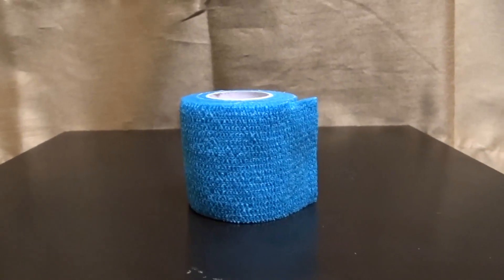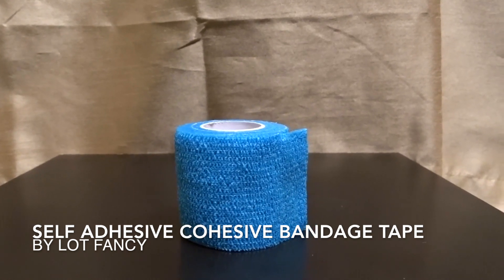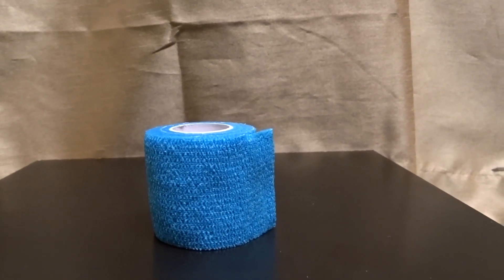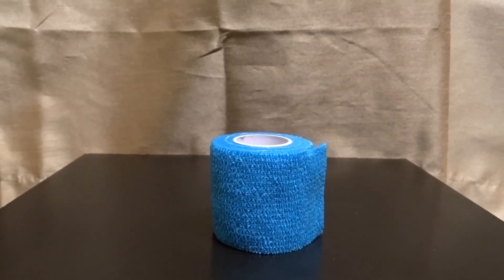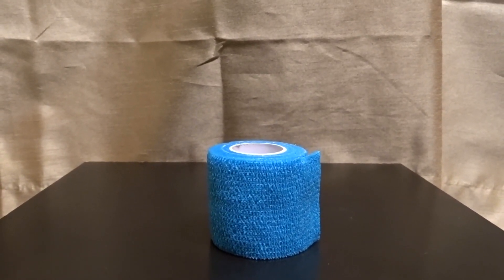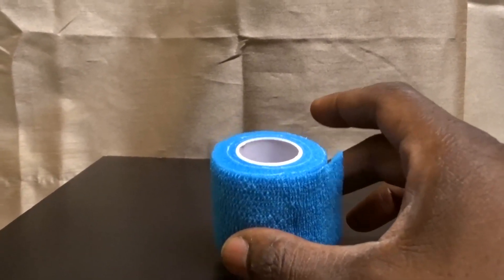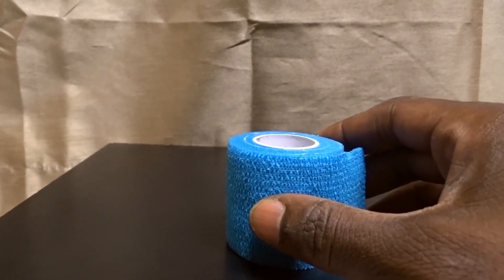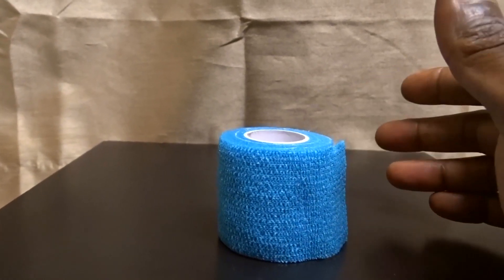What we're going to be talking about today is the self-adhesive cohesive wrap bandage tape. This is an adhesive that is probably very necessary to have — I would say in just about every first aid kit. It's a really good way to put on a bandage. First of all, it stretches very nicely and it sticks to itself and only itself.